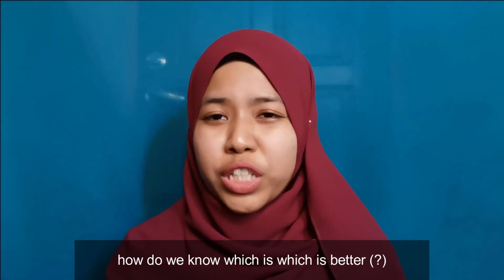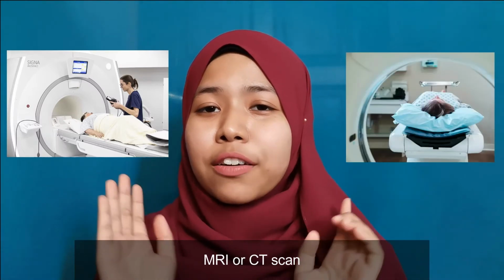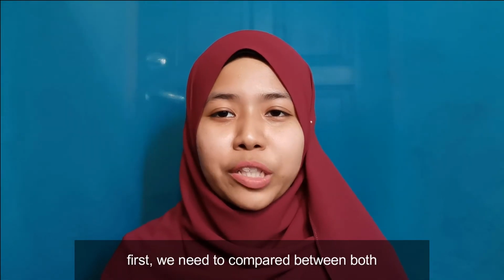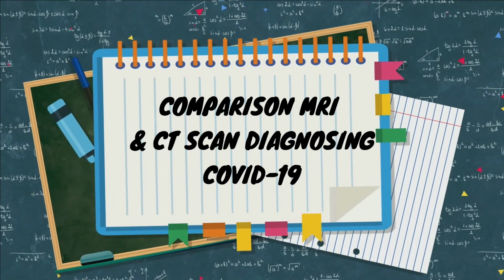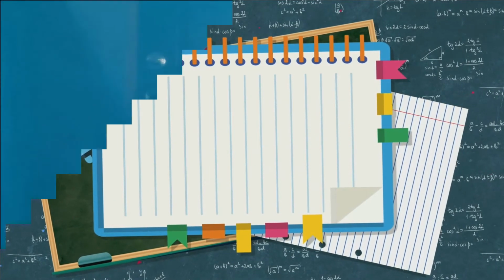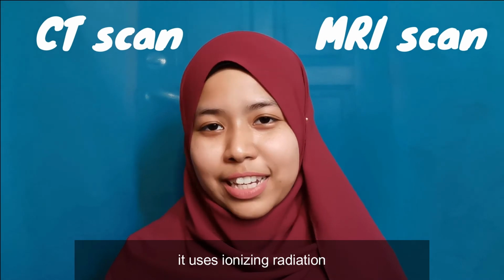How do we know which is better, MRI or CT scan? First, we need to compare between both MRI and CT scan. As for CT scan, it uses ionizing radiation.